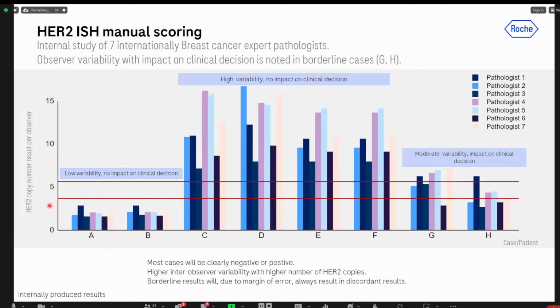And you can see that, these are the HER2 copy numbers results that we were looking at right here, and in those where we have very low numbers, you can see it's rather straightforward to count, and they were all agreeing to a level where it is acceptable. You can see there are differences, but the group where they assigned the case was all the same. And the same for the amplified, and these are mostly amplified with clustered cases.